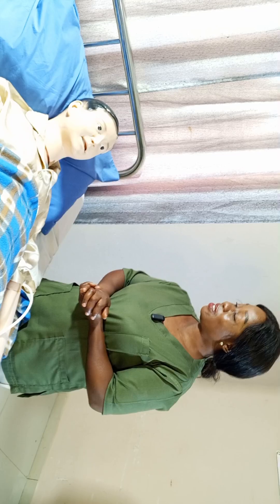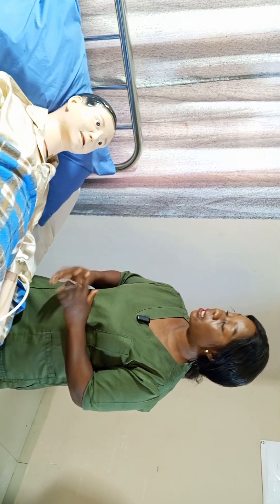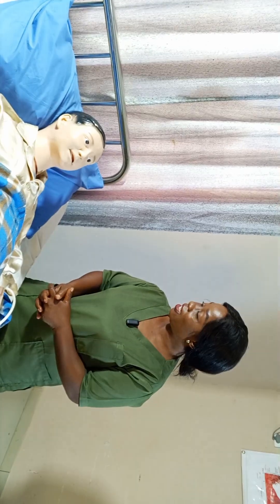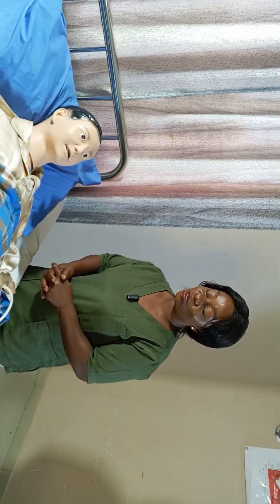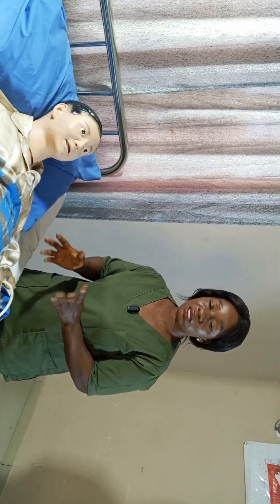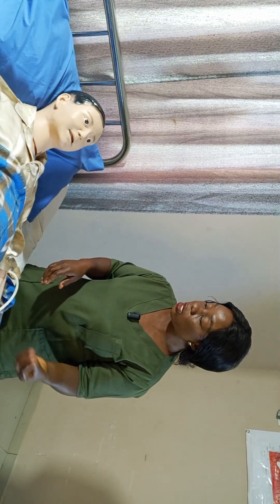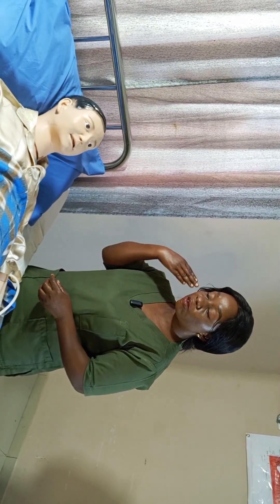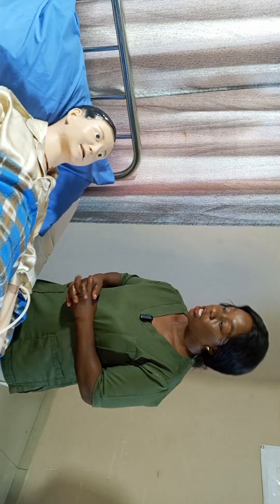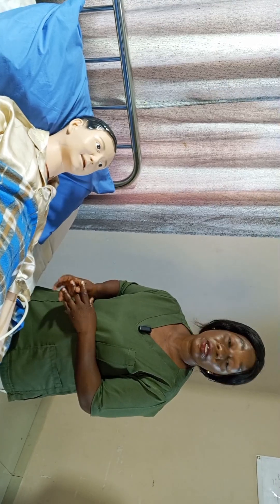Good morning, sir. My name is Nurse Clements B and I will be your nurse for today. Please can you tell me your full name and date of birth? So your name is Chiku Emeka Eze, date of birth May 1999. I am here to irrigate your ear. I'm going to use water and a syringe to flush your ear. It's not going to be painful, but there will be a little bit of discomfort. Is that okay?